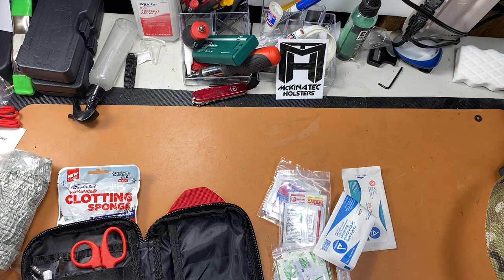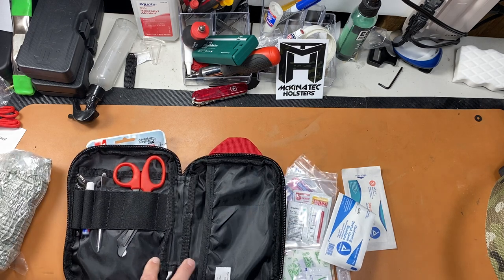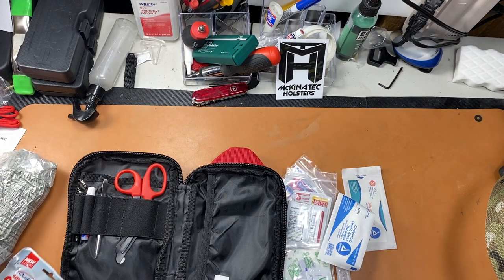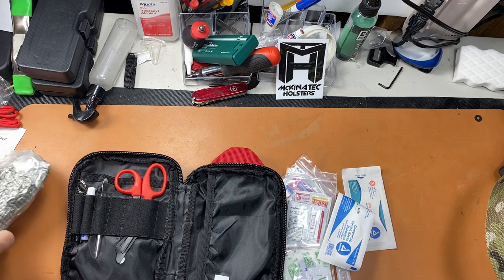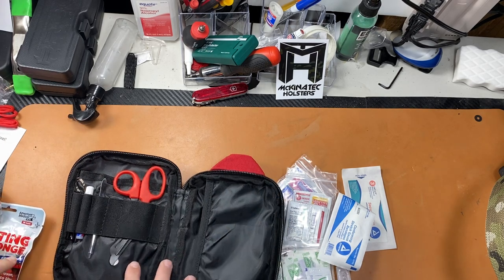The basic kit is $50 and the advanced kit is $100. With the advanced kit you get a chest seal, QuikClot, tourniquet, needle decompressor, and a couple of other items. Honestly, $50 extra seems like a lot for those individual items — you could buy them separately and build it out yourself.